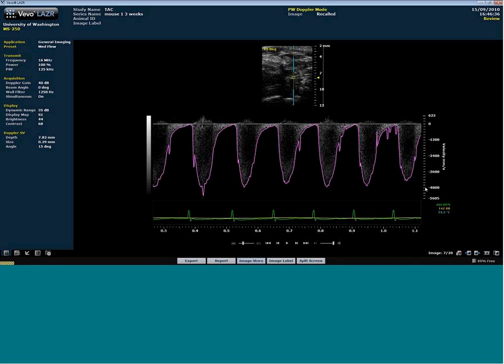We're at 4.8 meters per second flow coming out of the downstream side of the suture, that we've had to drop down to that probe to get Doppler velocity up to the area where we can measure. So changing probes is one important aspect.